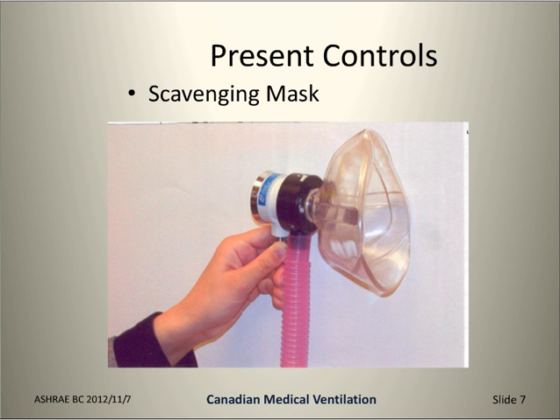She does need to seal it to her face and inhale to get the gas delivered, but when she's exhaling, obviously, she doesn't need it there. And our researchers observe that it tends to be out at arm's length a good bit of the time. In the back of the photo here is the demand valve, and the person holding it is holding onto the fitting where the gas supply comes in. We did check the airflow in that little pink hose, and it was in the order of 2 to 3 CFM, all the flow we got when we disconnected it from the valve.